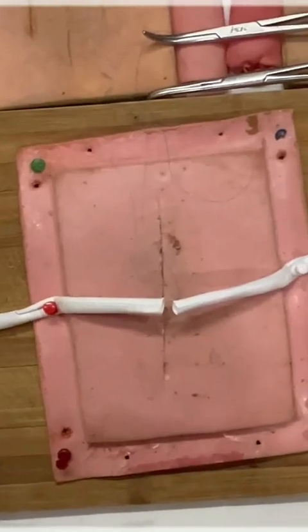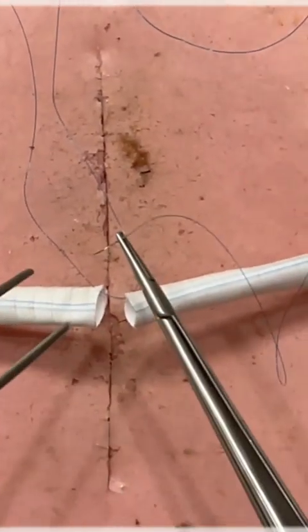So the trick is that we don't tie the corner suture. This is the 12 o'clock suture we have already taken, and we hold it with a rubber-shod fine mosquito forceps with the rubber tubing applied at the end. Otherwise, it can break. So we will hold it in one place, and it should be under a little bit of tension so that the suture ends remain aligned.